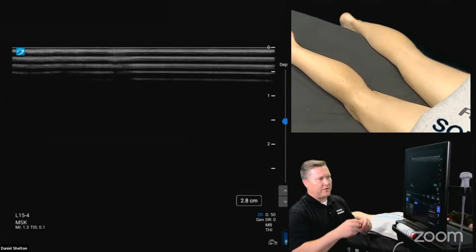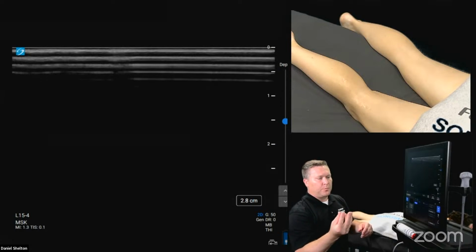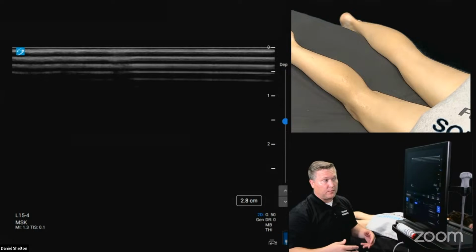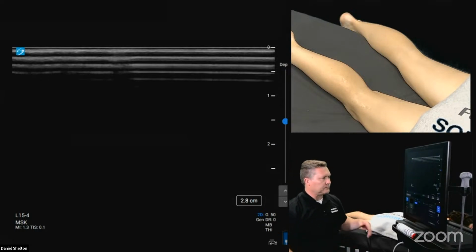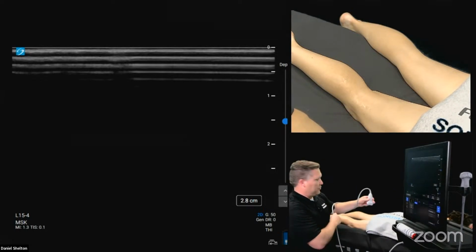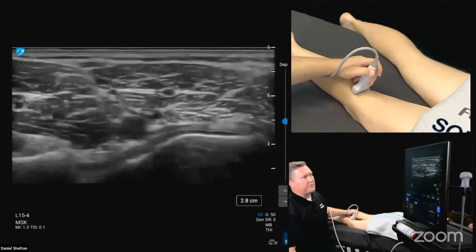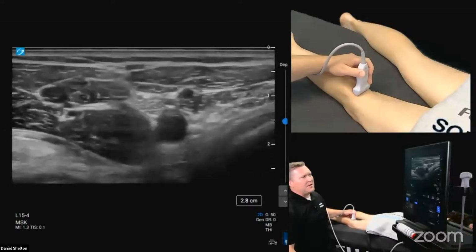So when you get your probe cover out, put the non-sterile gel on the top of the probe, then you can use your probe cover like a little puppet show and just grab that yourself without having to have an assistant there. I think just those little features of how the system is set up, keeping in mind the users that are more often than not in the procedure room by themselves doing a lot of these injections, just make it easier.